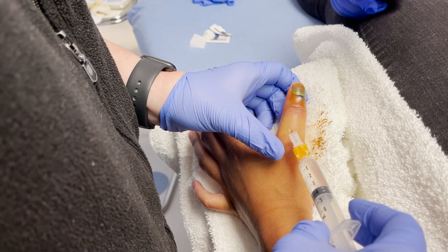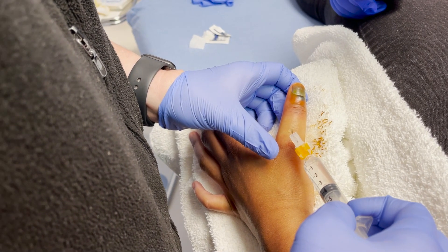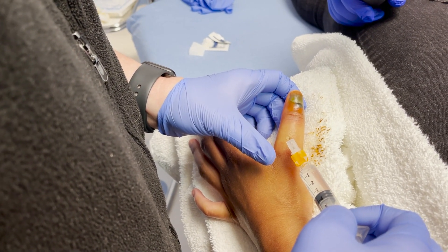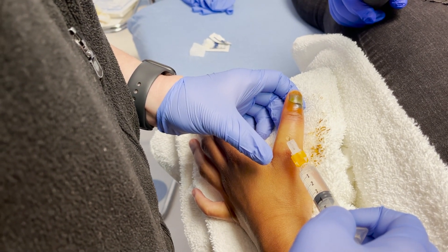While you're in there, just give a little bit more because we're going to put maybe another two or three on the ventral surface. The ventral has a little bit more subcutaneous tissue.